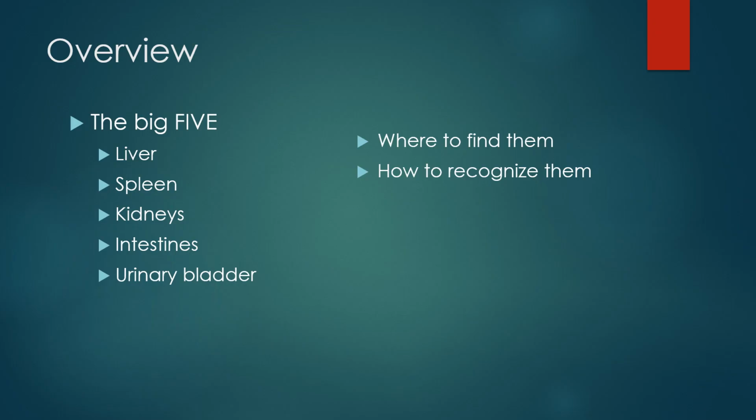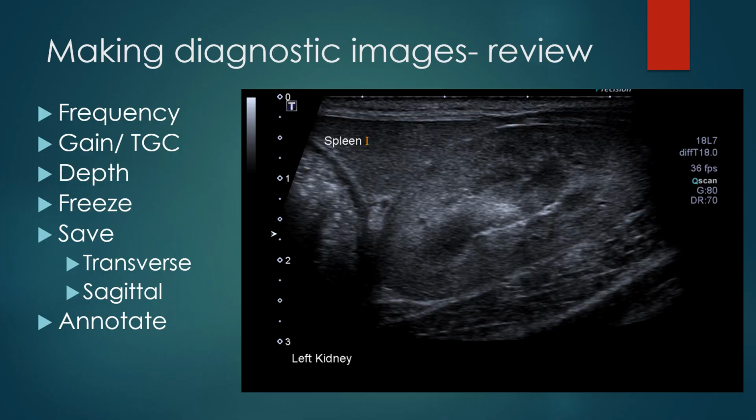So using your knobs, changing your depth, your frequency, your gain, all of those things we've already covered, but I will try to point out some key things as we go. Okay, so again, quick review of how to make these diagnostic images.